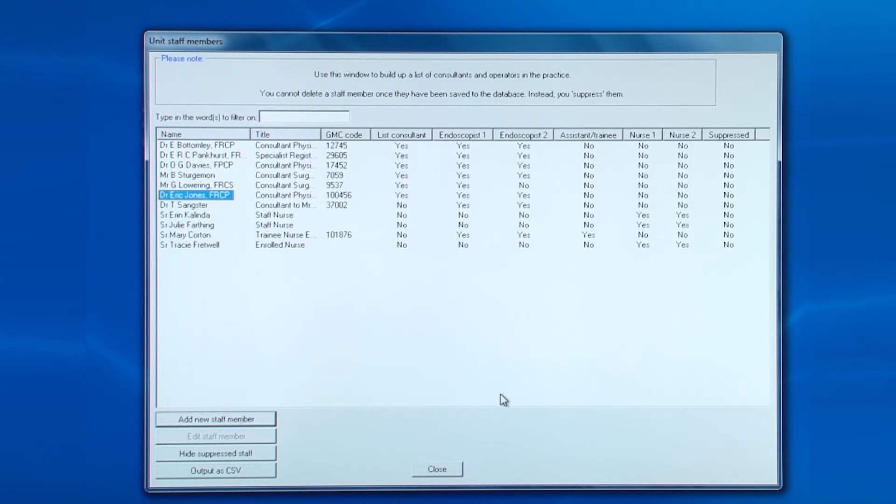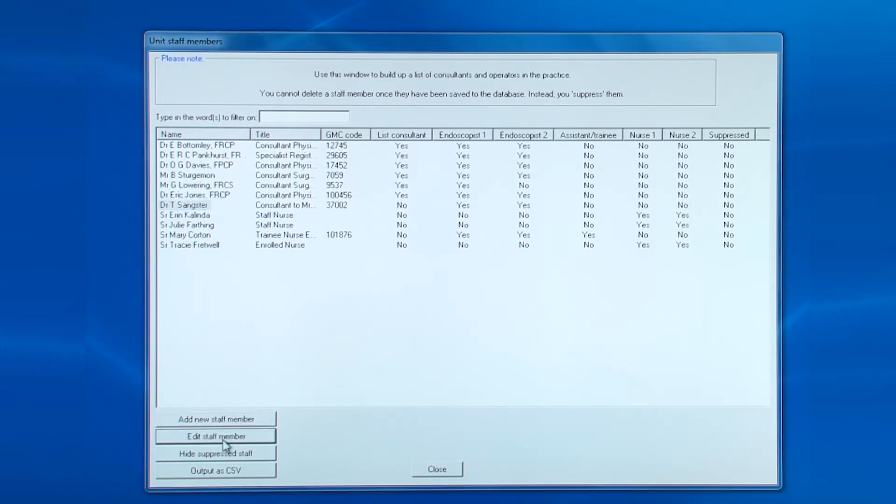So now let's look at editing a staff member. Let's say that Dr. Sankster is made up to a consultant and he's based at just one of the hospitals.